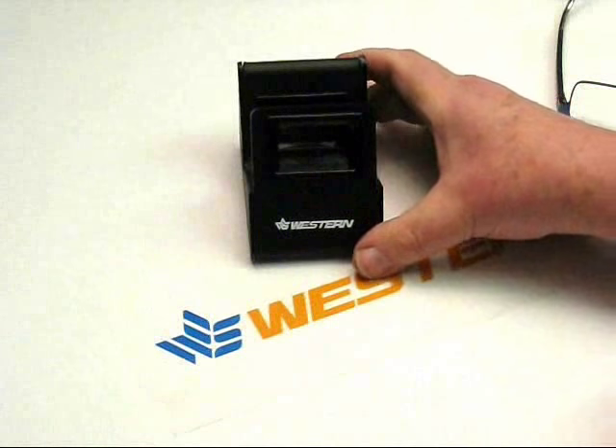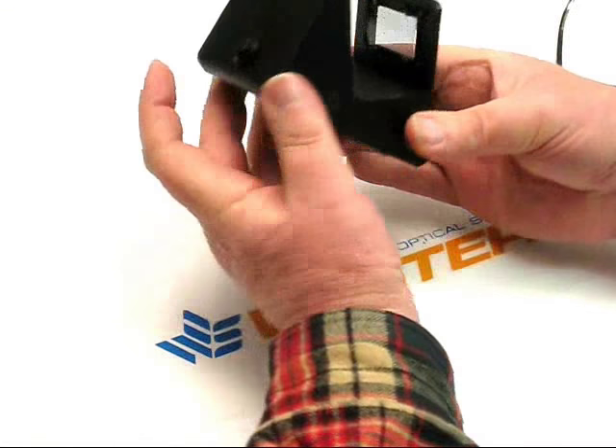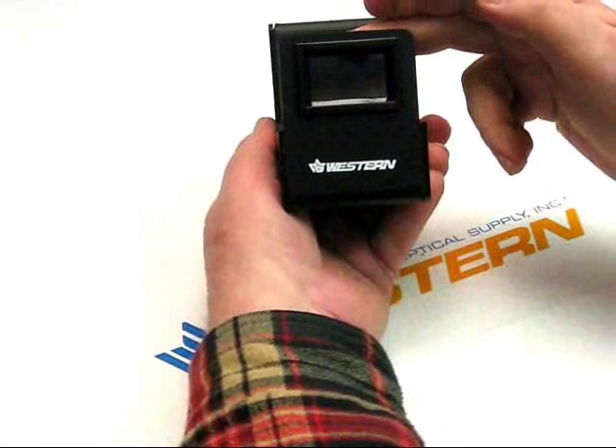This is the Western Optical Supply Polariscope, and it consists of a handheld unit with an on-off button in the back, and two sheets of polarized film.